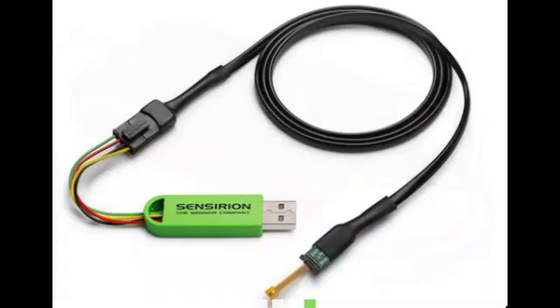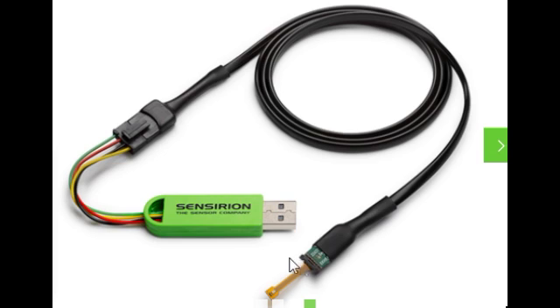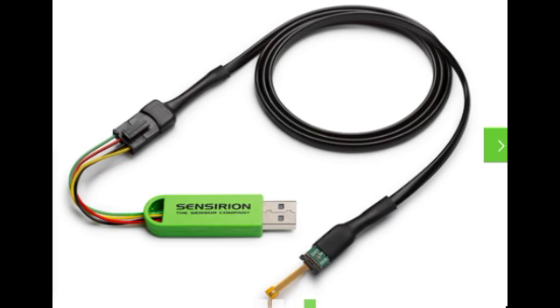In order to do a first evaluation of the sensor, we bought this evaluation kit, the EK-H5. Here we can see the evaluation kit, it converts from I2C to USB. We will use this kit to do a first test of the sensor.